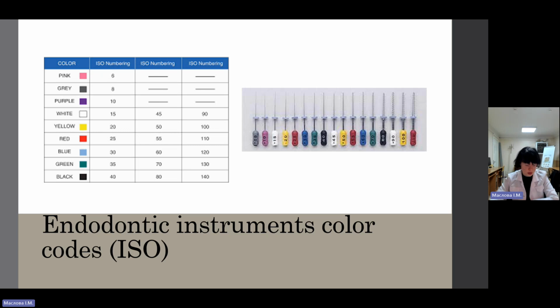The number 1 is quite fragile but may be used at ultra slow speeds provided it is loose in the canal. Advantages of pre-enlargement and establishment of straight line access. There are a number of advantages from achieving straight line access.